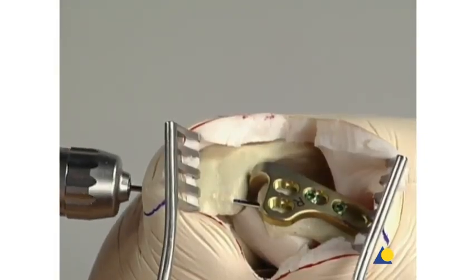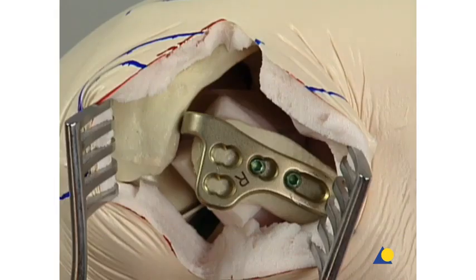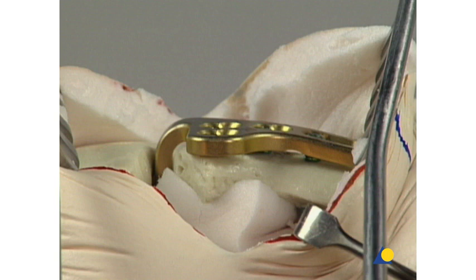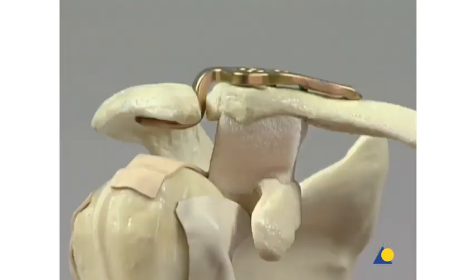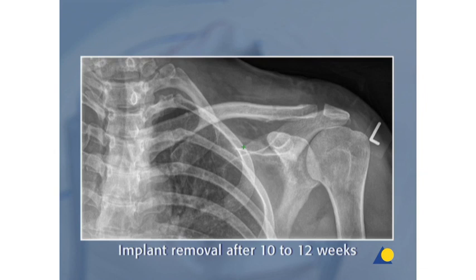The K wire used for temporary fixation is removed. The correct final position of the implant can be seen here. The implant is usually removed 10 to 12 weeks after implantation and healing. It is recommended that the LCP clavicle hook plate be removed to prevent osteolysis of the acromion or impinging on the rotator cuff.